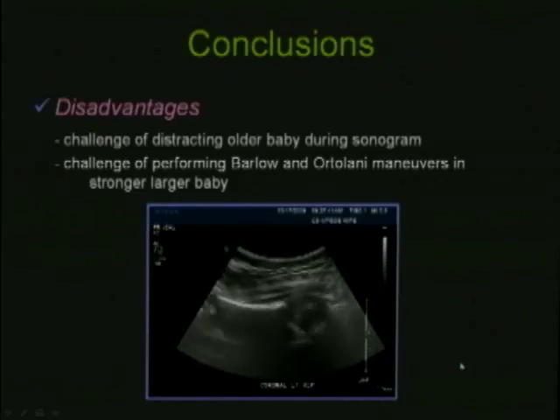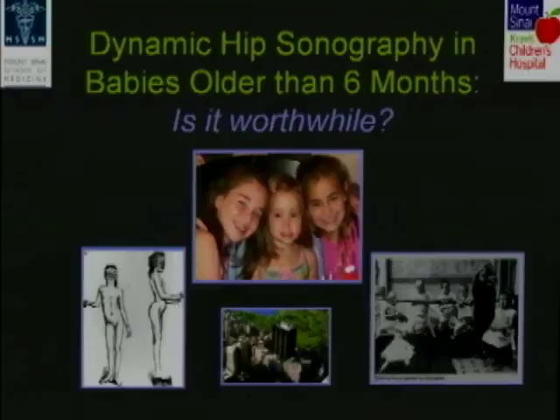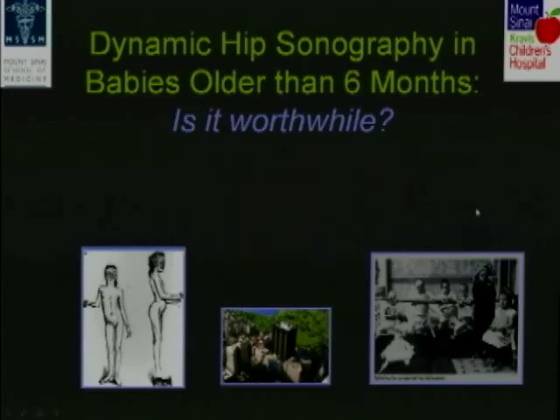There are disadvantages, and that is the challenge of distracting an older baby during the sonogram. We will be feeding them, singing, dancing, entertaining them, showing them Game Boys and videos to try to get them to cooperate, and even with that, it's not always easy. They're ready to get up and run away from us. The other challenge is performing the Barlow and Ortolani maneuvers in the stronger, larger babies. So we concluded that dynamic hip sonography in babies older than 6 months really is worthwhile.